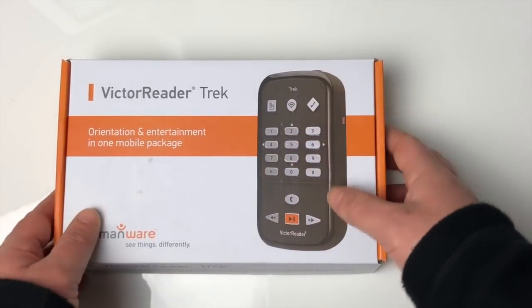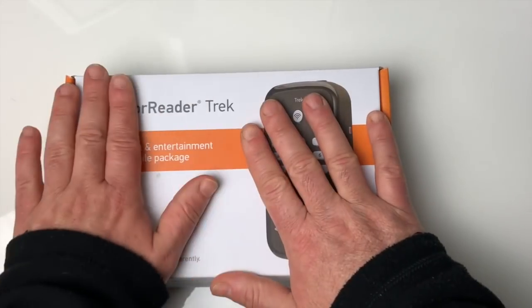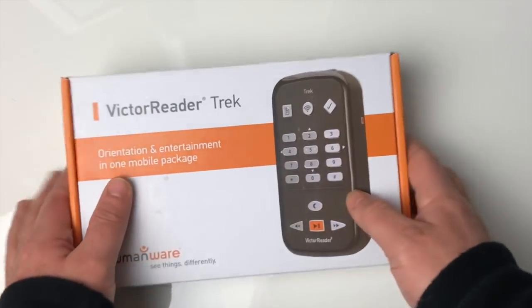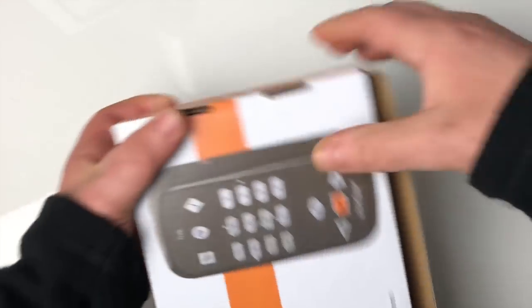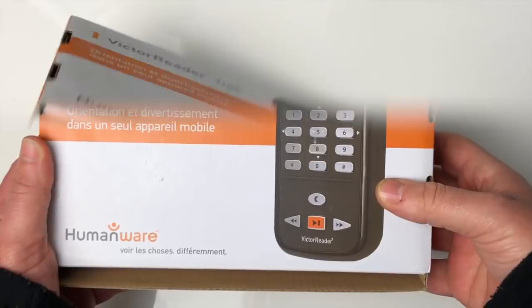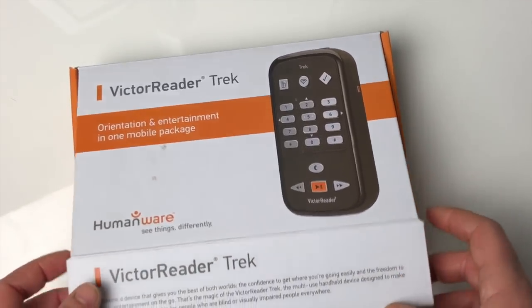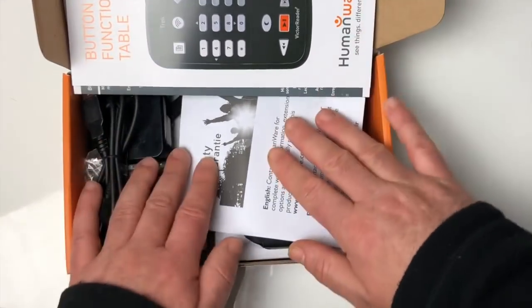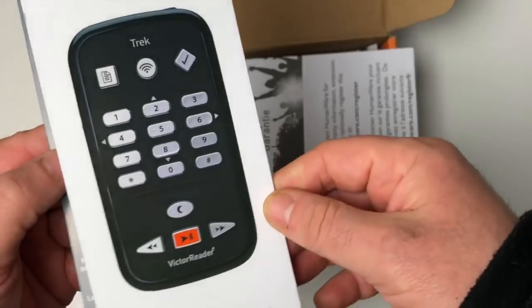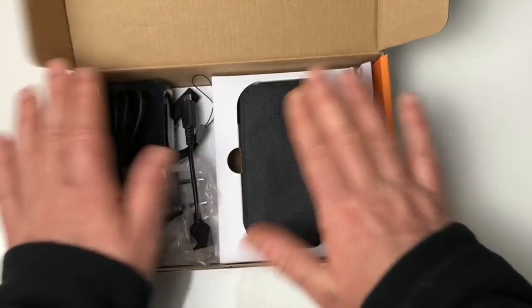Voilà donc comme d'habitude, la boîte est sur le bureau. On a une boîte rectangulaire avec le nom marqué en haut à gauche et une photo de l'appareil sur le dessus. C'est une boîte classique. Dessous, on retrouve la même situation avec l'appareil à droite et le nom de l'appareil. On va maintenant ouvrir la boîte : lorsqu'on la lève, on tombe tout de suite sur un dépliant expliquant ce qu'est le Victor Reader Trek, et directement sur les éléments de la boîte.